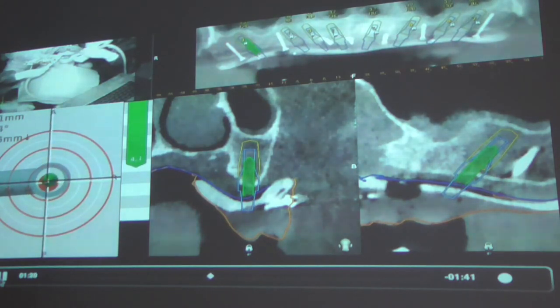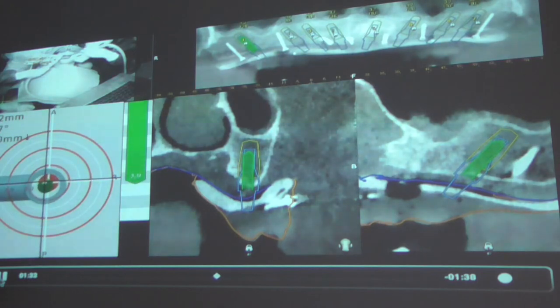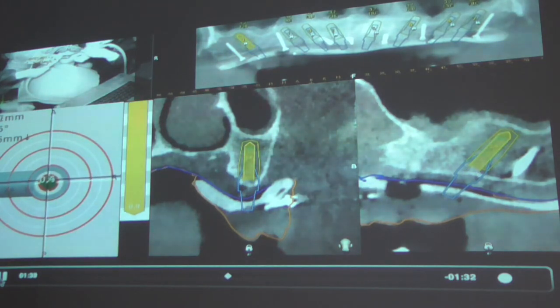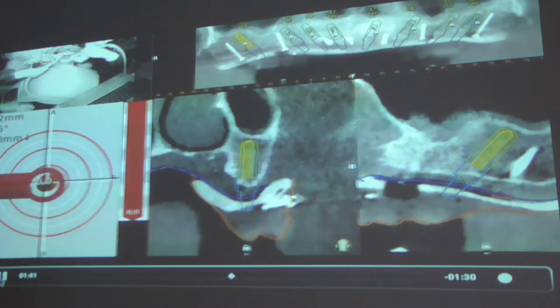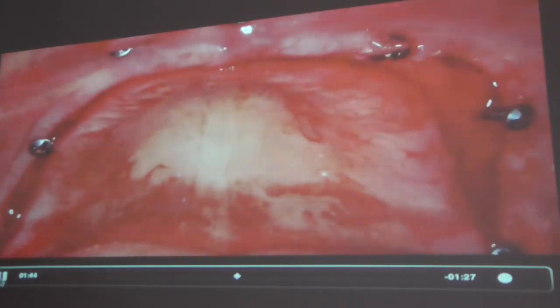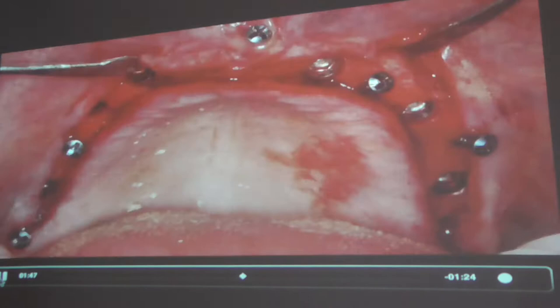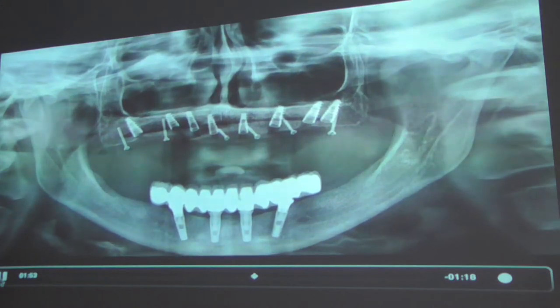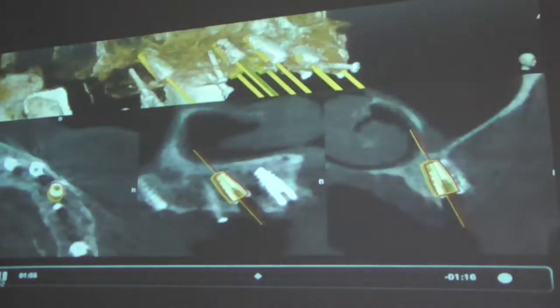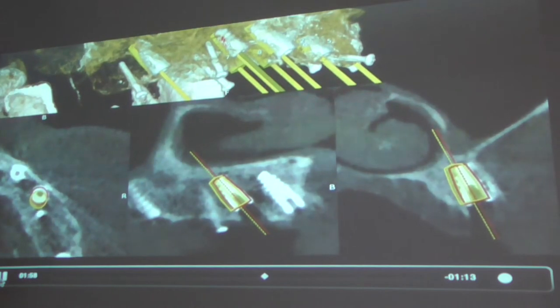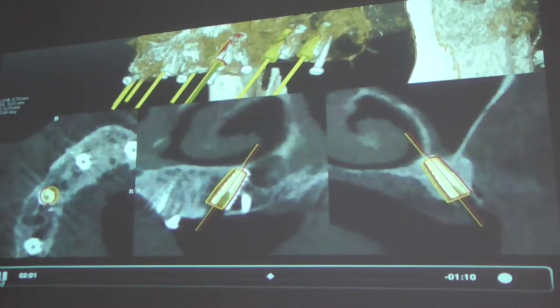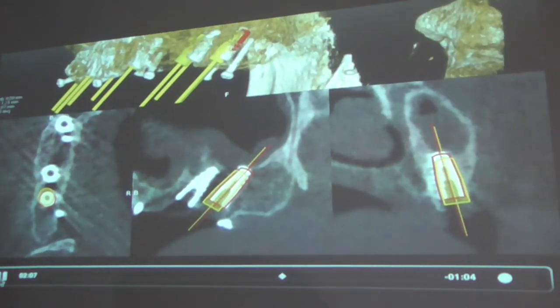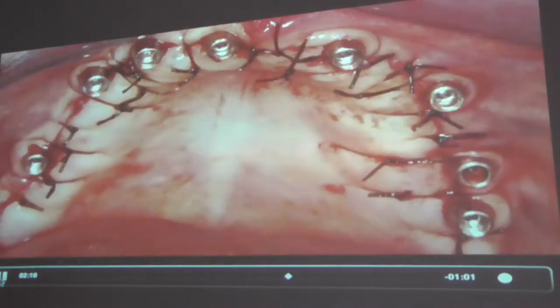Another advantage is that you don't have to open the whole gingiva — you just make a very small precision incision. I do it for the attached gingiva; I want to have good gingiva from the buccal side and also from the palatal side. Then I'm checking all my drilling with Navident, checking the degrees of angulation of the implant as shown here, and they are getting precisely done.